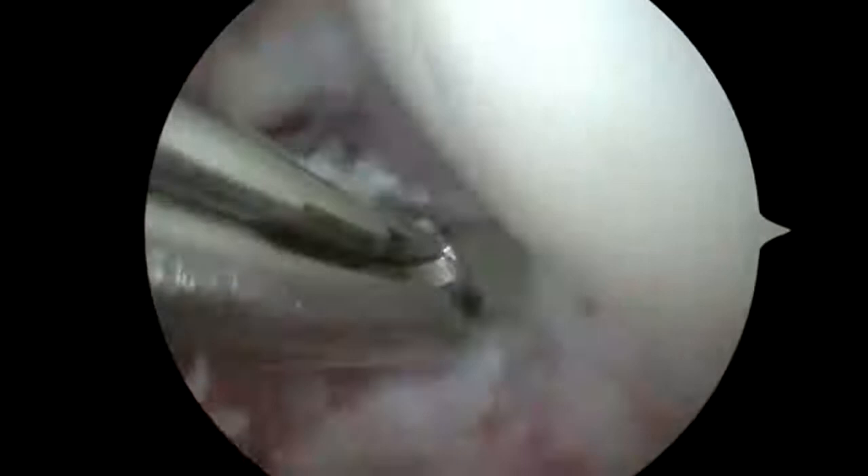See all the red inflammation to the left. Again, you can see how tight that is on the right. I'm just going to keep cutting, work my way around.